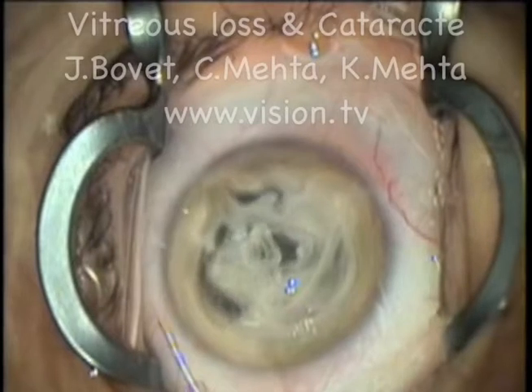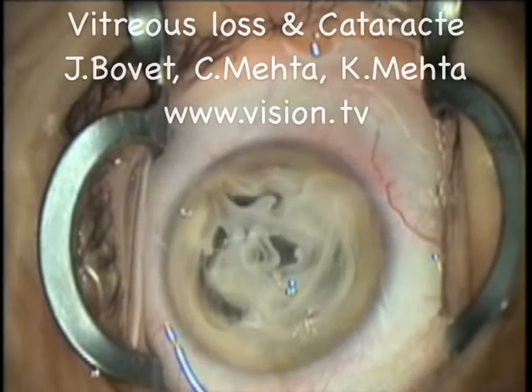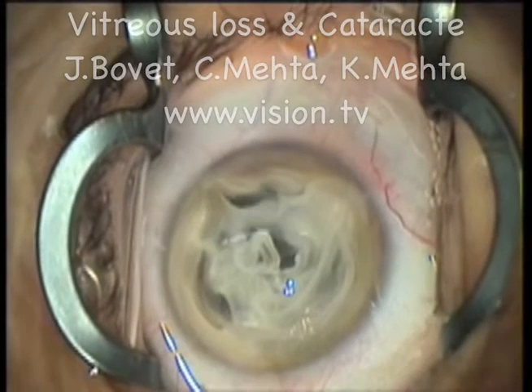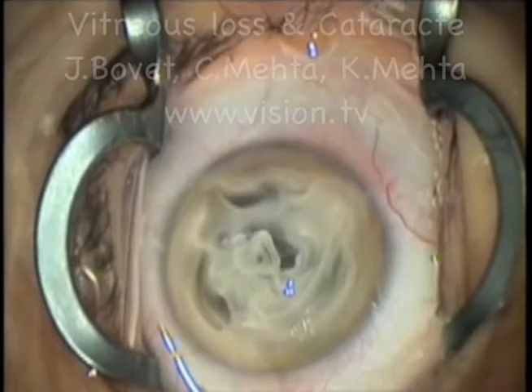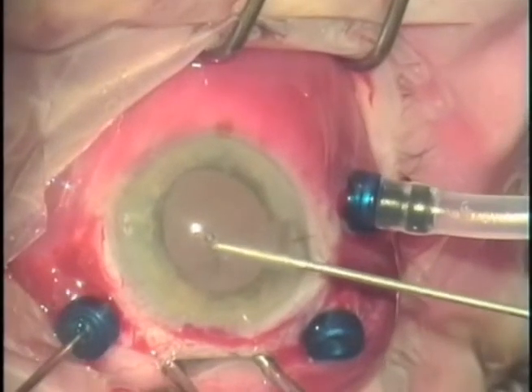The capsule has broken and now the planned routine cataract surgery has unexpectedly become complicated. Should a nuclear piece fall posterior, do not chase after it. It is far better to refer the patient to a retinal colleague for a pars plana vitrectomy than risk a retinal break or detachment.